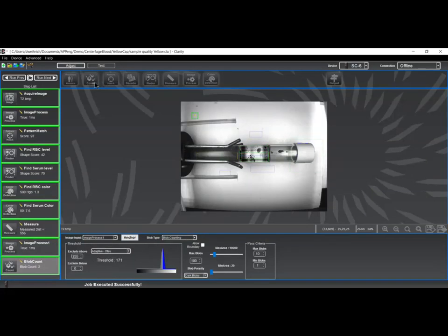Now I apply an object count to that area, and what I'm looking for is blob counting, and I'm looking for dark blobs on basically a lighter background. This is my area of processing interest. I'm going to move that into the relevant area in the serum, and again I'm going to anchor this to the serum level. We're going to use adaptive thresholding for the process and work from the background.